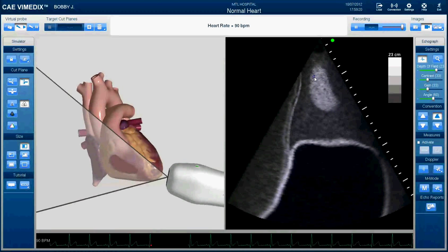An important difference about this view is that we don't have a lot of the things that make ultrasound difficult. We don't have bones, we don't have other organs. Bones would provide shading that could cover structures you're trying to visualize, and we don't have that here. What we have is a pretty idealized version of what the heart is going to look like on ultrasound.